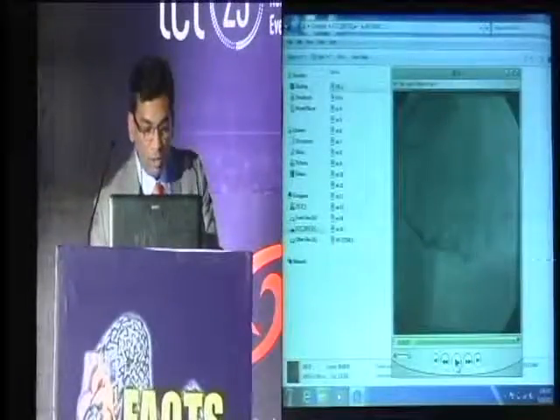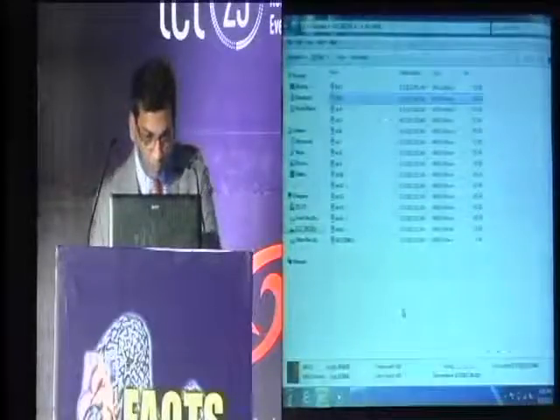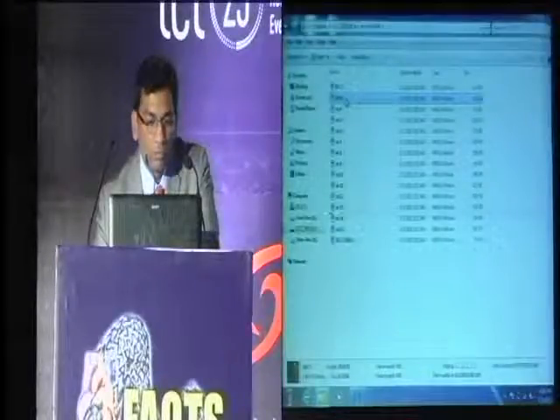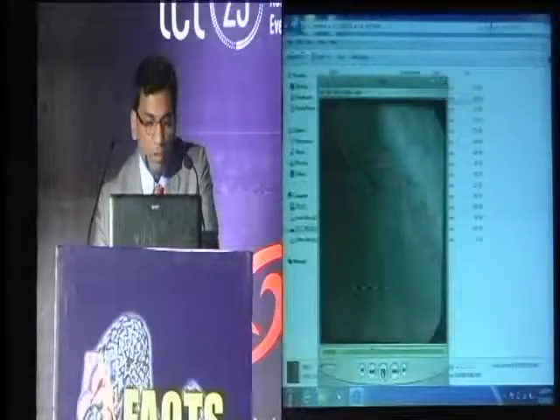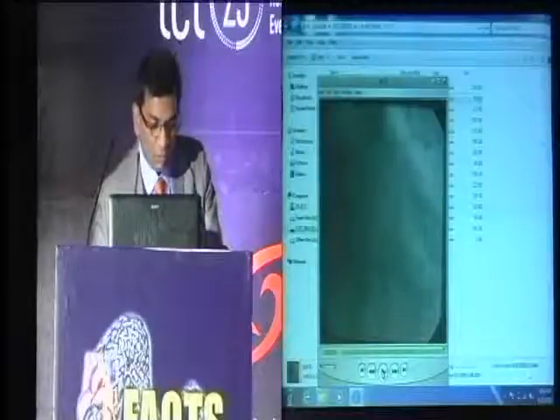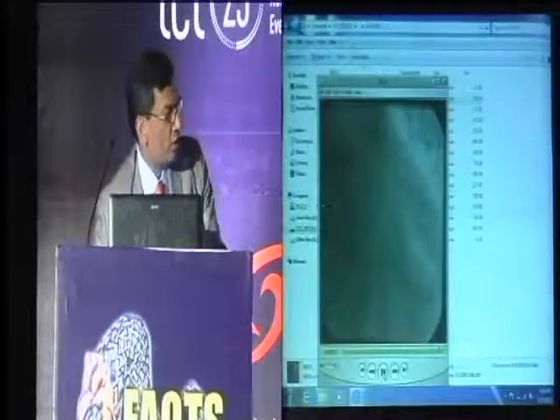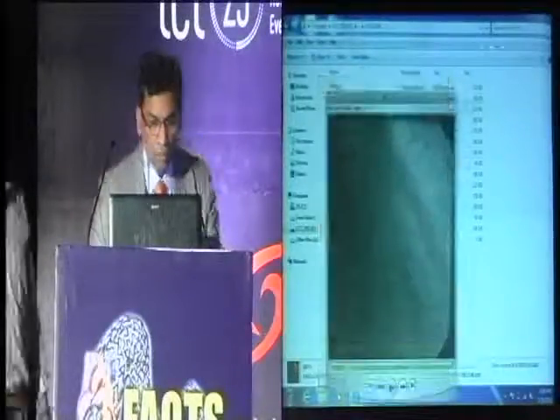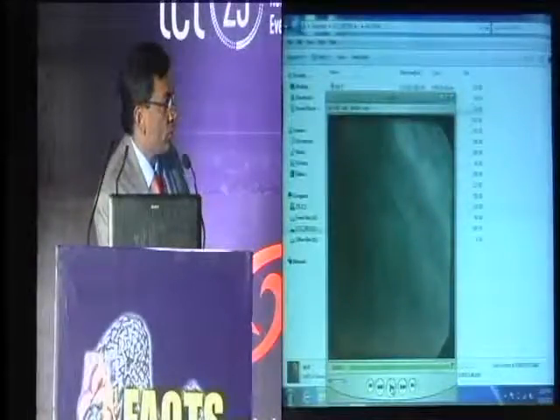That's the right coronary artery, relatively disease-free. This is our left system. As you can see, there's a complex LAD diagonal stenosis with significant thrombus burden. So we wired the LAD first, which is obviously the main vessel.